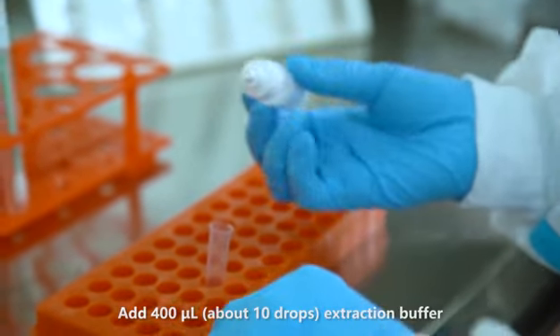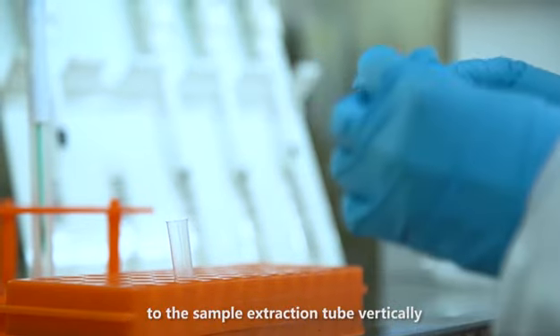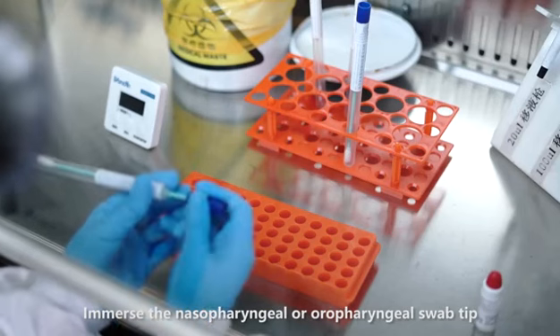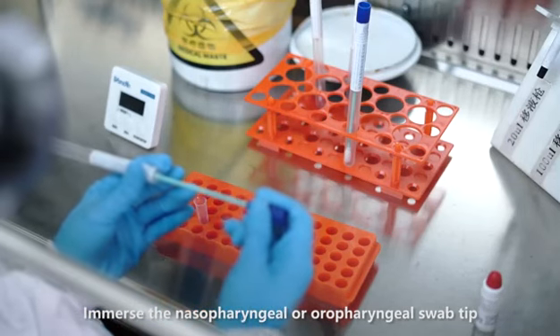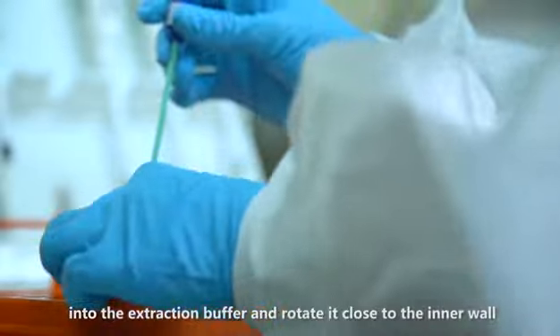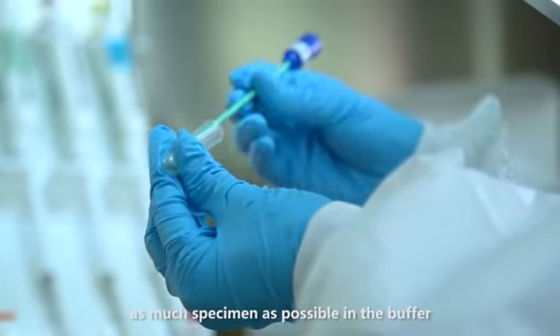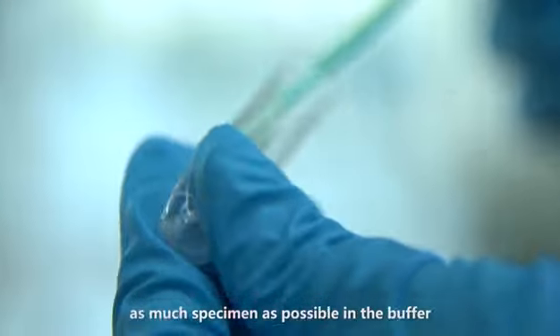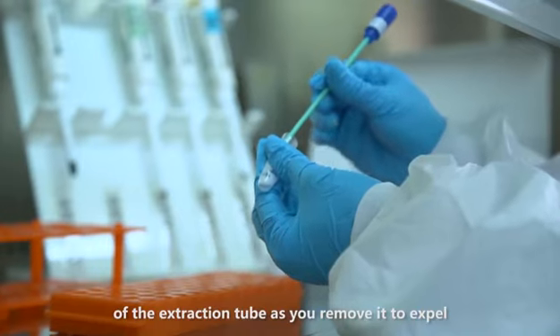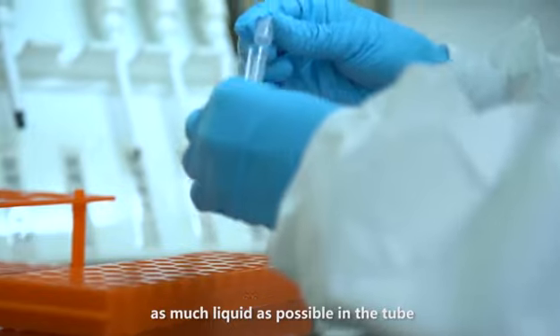Add 400 microliters, about 10 drops, of extraction buffer to the sample extraction tube vertically. Immerse the nasopharyngeal or oral pharyngeal swab tip into the extraction buffer and rotate close to the inner wall of the tube for about 10 times to dissolve as much specimen as possible in the buffer. Squeeze the swab head against the inner wall of the extraction tube as you remove it to expel as much liquid as possible in the tube.